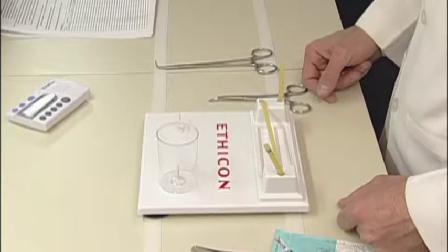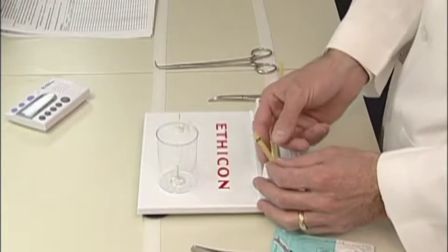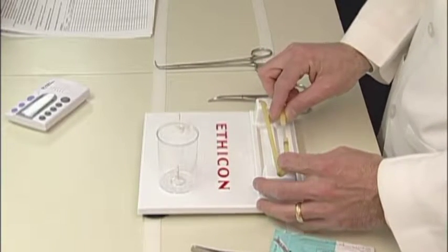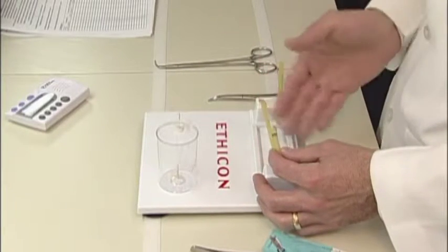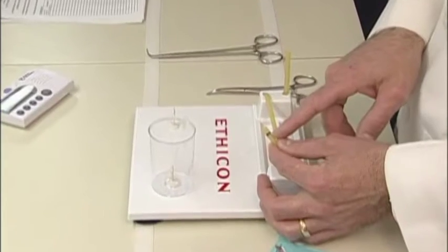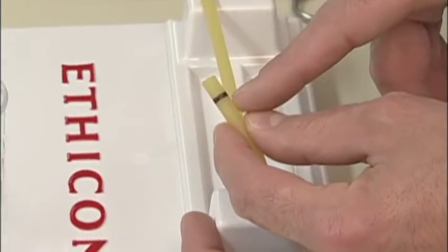Task 3 is a tie on a pass, and so for this exercise we've got this knot tying board. We've got one of these large rubber tubing segments cut, and we've got a 2mm target line that is inscribed on this tubing.